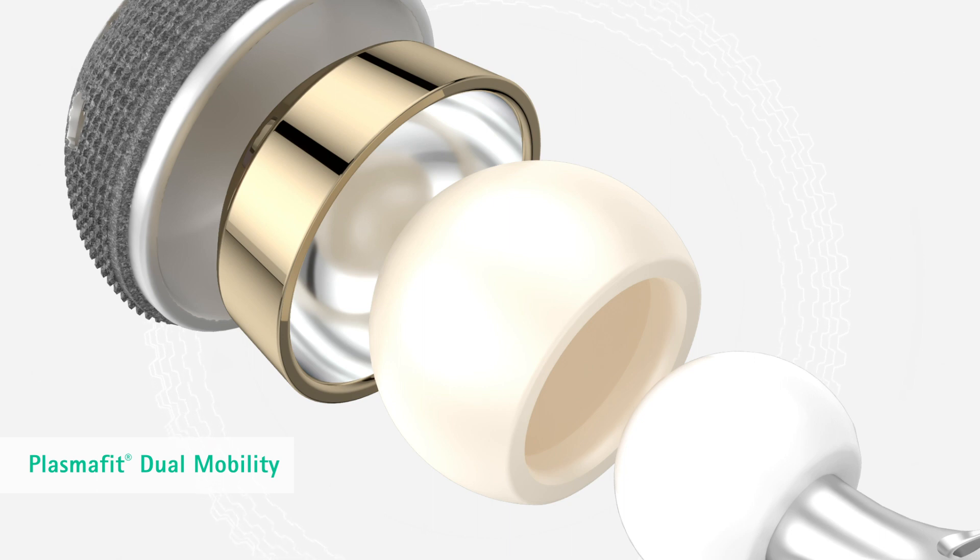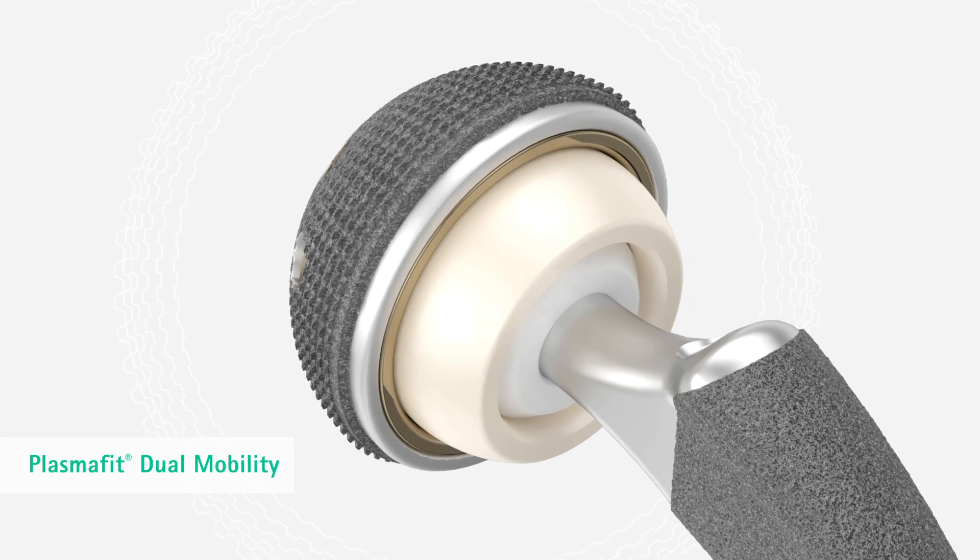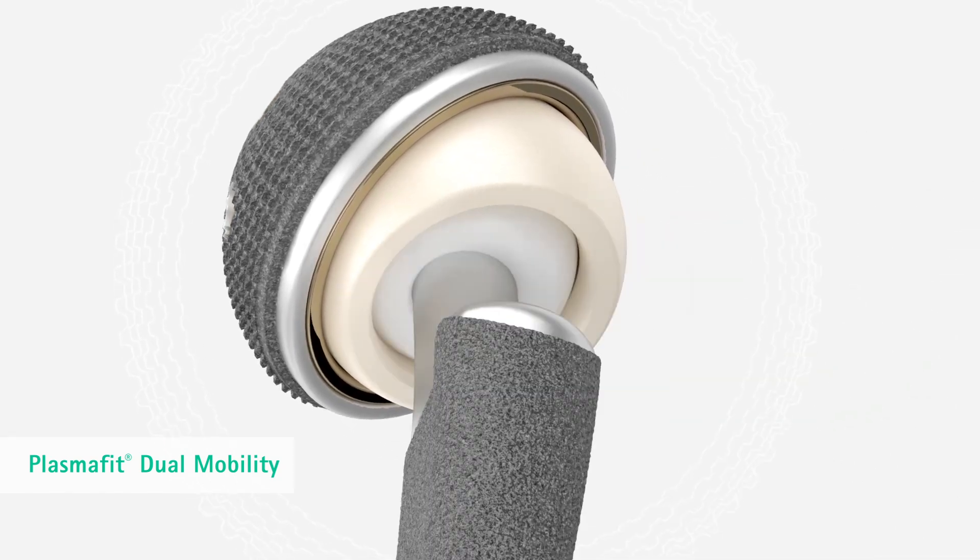An additional treatment option offers the use of modular dual mobility liners that support post-operative joint stability with high range of motion. On the outside, the liner is coated with a ceramic multi-layer coating that supports the corrosion resistance of the outer surface of the dual mobility liner.